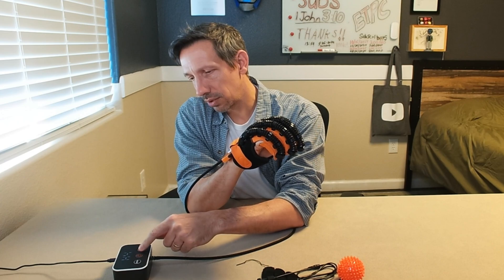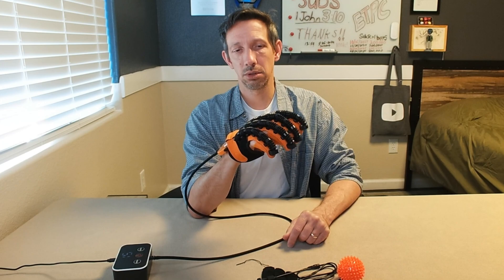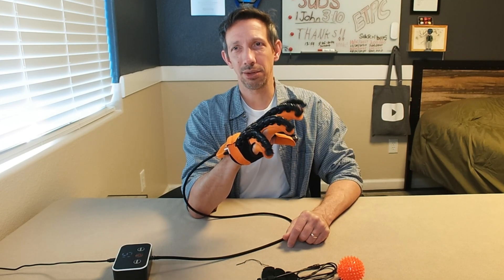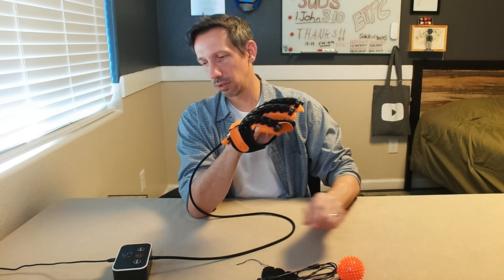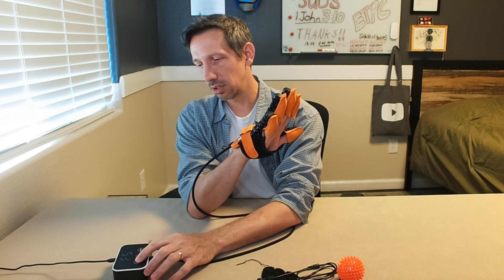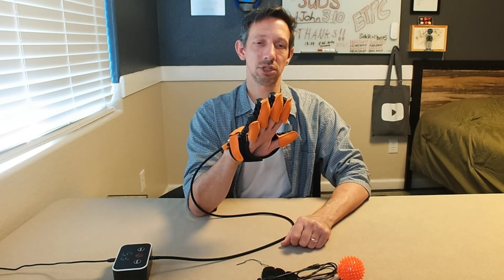One through five on the force — see how powerful that is. Obviously I can resist it, but it's pretty strong there. Almost like a little workout, like extending your fingers. And then the speeds, one through five — super easy to adjust that actually.